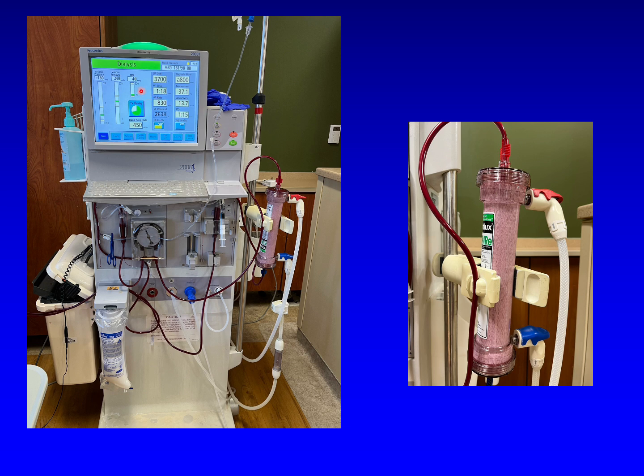The screen of the dialysis machine shows such data as the patient's most recent vital signs, the patient's blood flow rate, here 450 mLs per minute, and the amount of ultrafiltrate to be removed from the patient during the session, here 3.7 liters in 4 hours, with 2,638 cc's already removed and an hour and 15 minutes remaining in the session.